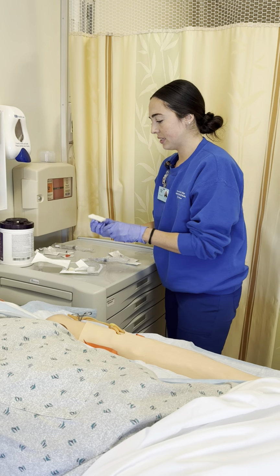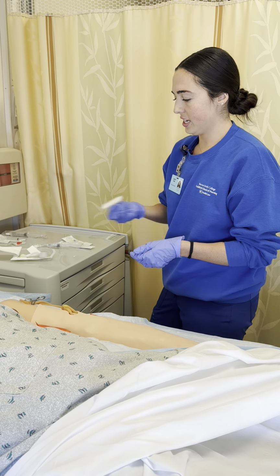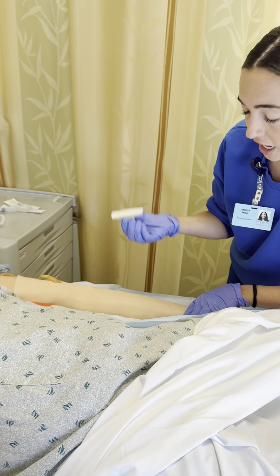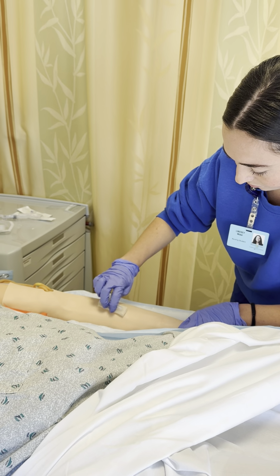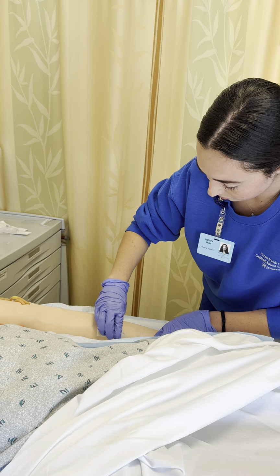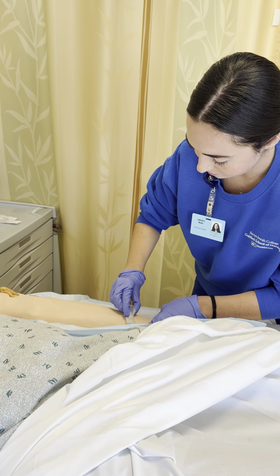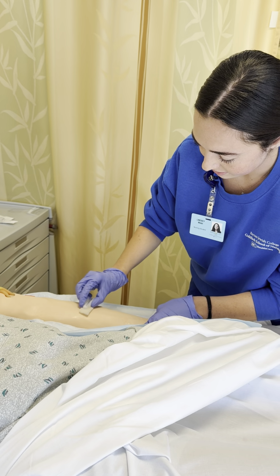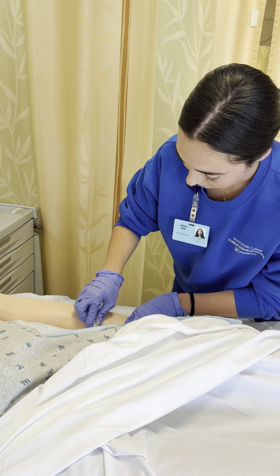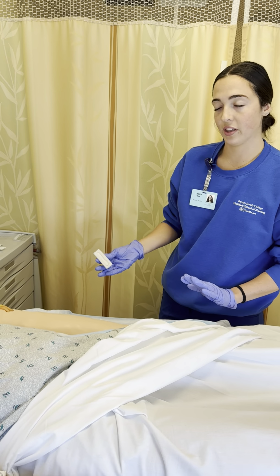The first thing I'm going to do is get my chlorhexidine. I'm going to crack it here, and I'm going to shake it. All right. And I'm going to go in an up and down motion, and side to side, and in a circle. So this just ensures that my area is clean. I'm not going to dry it off, and I'm going to let that sit.